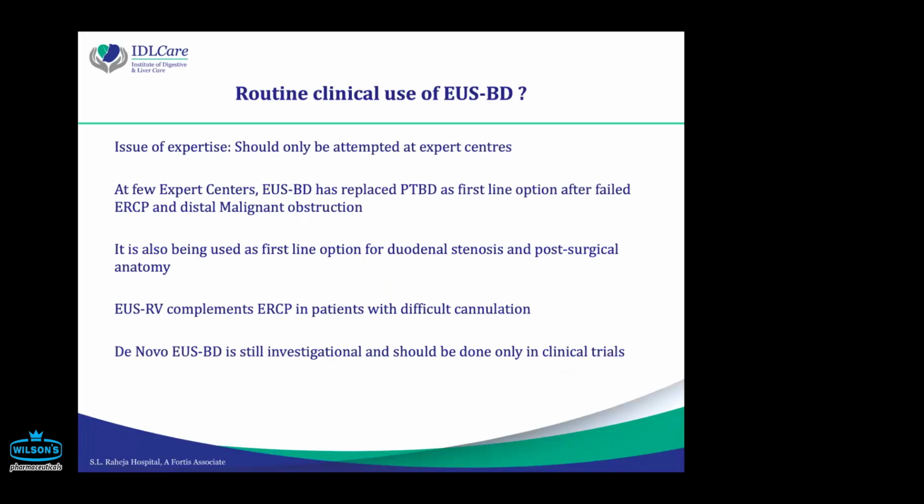So the question that comes is, should we use EUSBD routinely in clinical use? If you have gained enough expertise, please use it. It's a very useful procedure. It reduces your referrals to the interventional radiologists. It makes your patient happy because you will finish the procedure in a single sitting. If your ERCP fails, immediately change the scope, shift to the EUS scope, and complete the procedure.